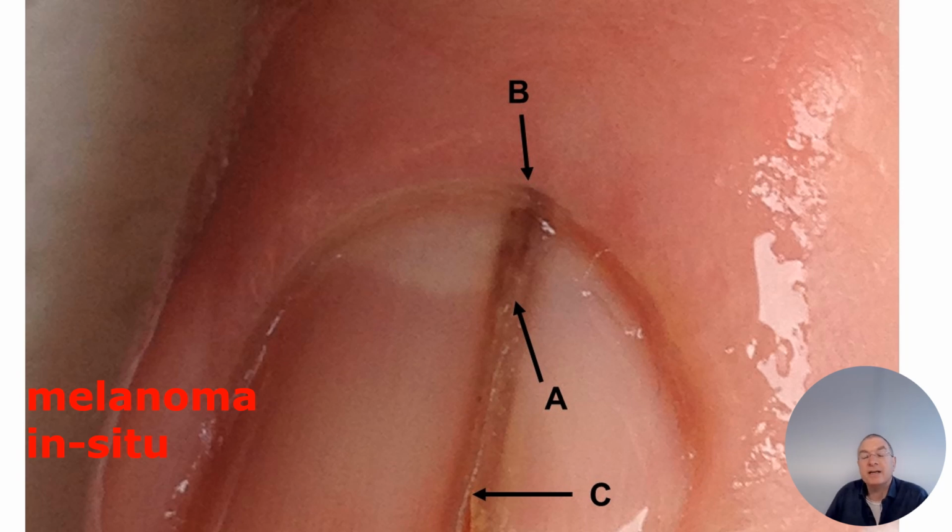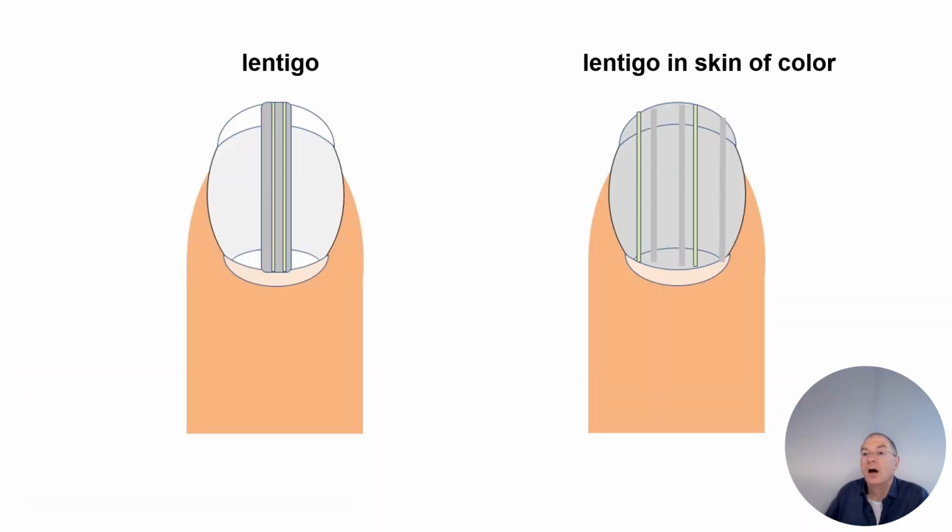Very easily diagnosed with a mobile. Just take an image. Just apply a little bit of liquid on it. I use a little bit of olive oil, so I can reduce the impedance, the gap between the air and the nail plate, so I can better look inside. So, melanoma in situ. Also, we can have longitudinal grayish colors, complete colors.